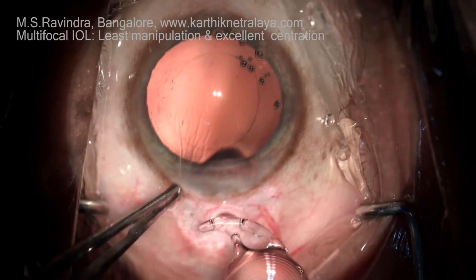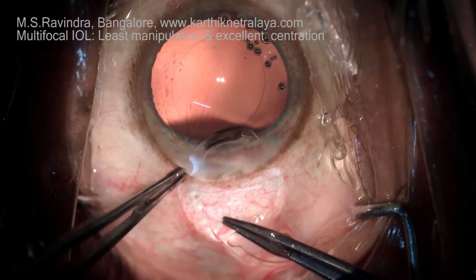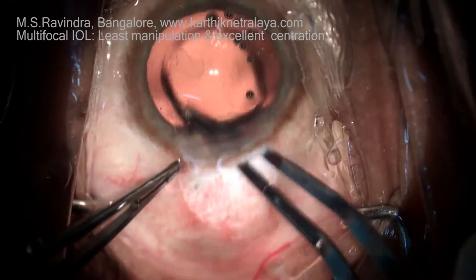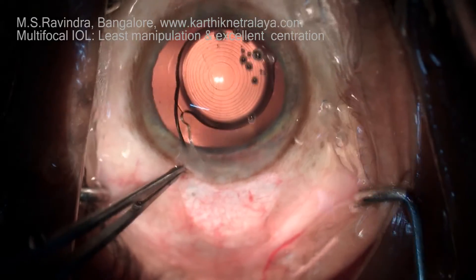A diffraction multifocal lens offers the highest amount of correction for presbyopic refractive error that is inevitable after a cataract surgery and intraocular lens implantation.